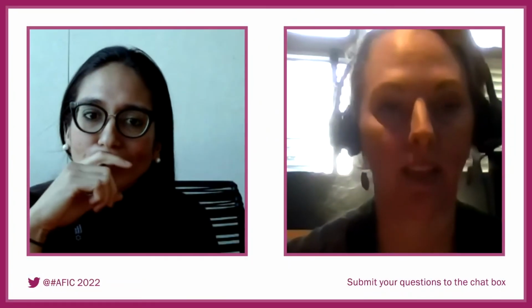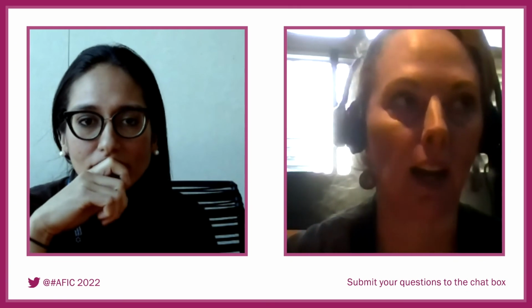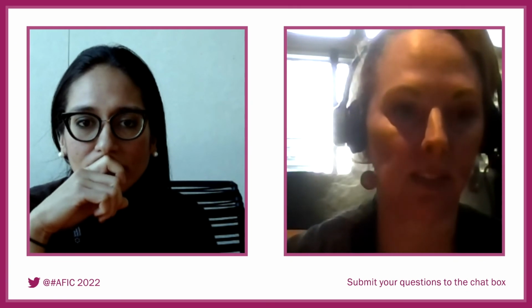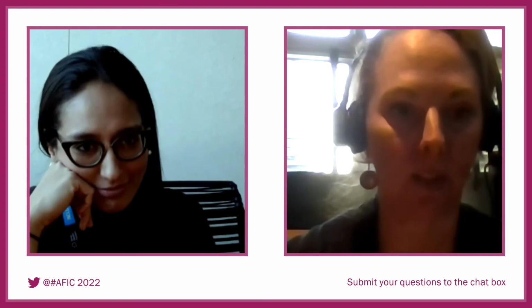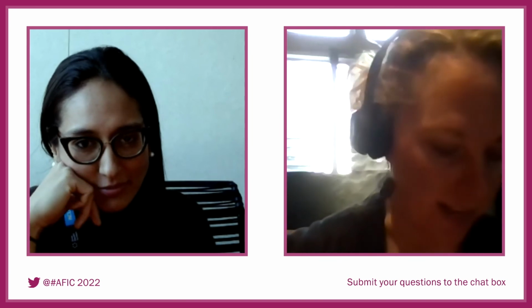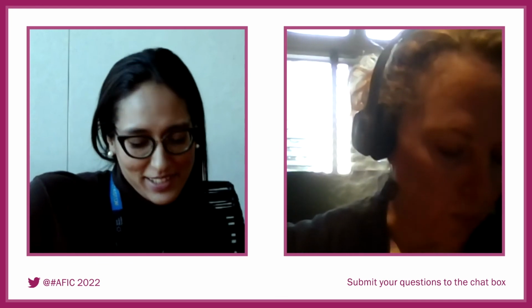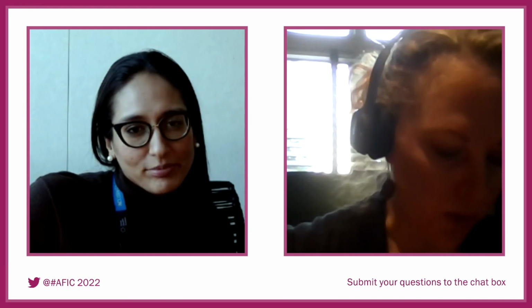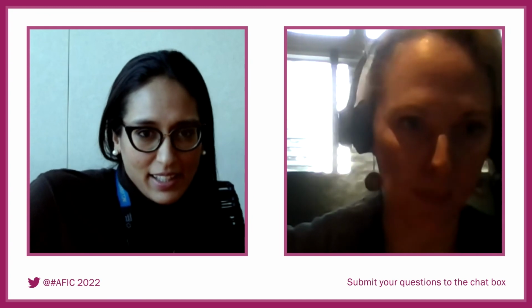That's great. Thank you. I think that's a really key point, that you have to have things that are reproducible and consistent. It's very difficult for a patient who gets something very different every time they come for an ultrasound: oh, this is lethal, oh no, this is a good prognosis. Absolutely. And then one last question, because I know it's time for the movement break. When is the best time to do your fetal lung volume assessment, the O/E LHR? What's the best gestational age, and do you repeat it as time goes by?